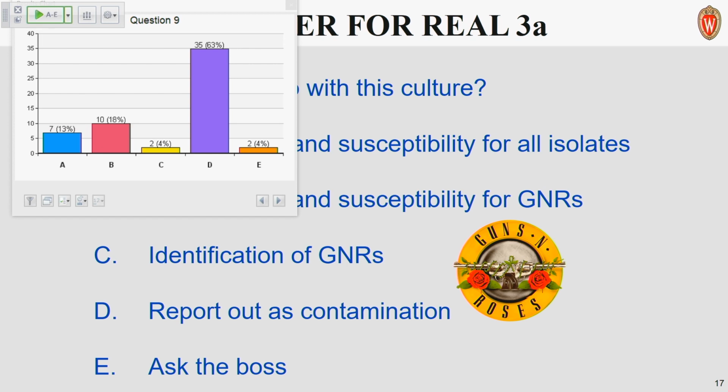We use CNA more as a backup, not initially when using MacConkey and blood. So if we have someone with Proteus and we can't tell if the sample's mixed, or if there's a predominant gram-positive, we will set up a CNA the next day with an alcohol pad that kind of prevents swarming. So not in a primary situation, but in a backup situation. Fair enough. Anybody else?